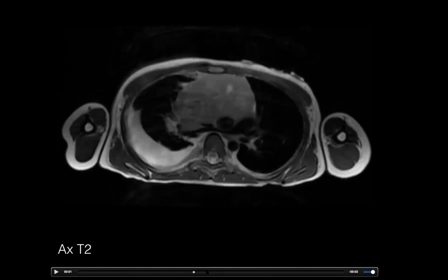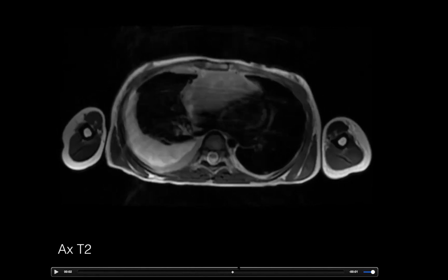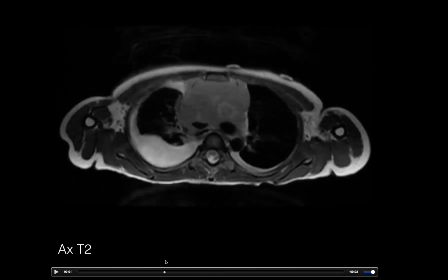With ultrasound, we just had no idea that there was actually this problem, but this entire thing is a mass. It's a tumor all through here. So this huge thing is a tumor. And then there's all this abnormal fluid around the lung. So this very bright is just pure fluid. And of course, the dark is the air of the lungs, which doesn't have much proton density.